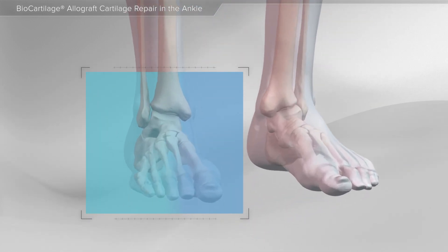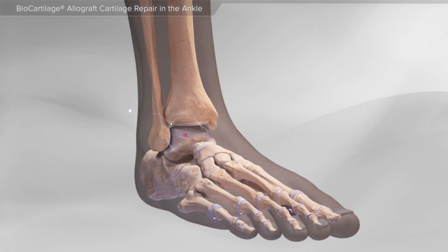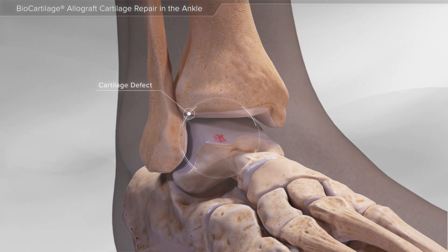In this animation, we will show a cartilage defect repair of the ankle using biocartilage matrix. Cartilage injuries in the ankle are from direct impact on the ankle joint from ankle sprains and ankle fractures. Cartilage will not regrow, so any loss of cartilage may require surgery to help with symptoms.